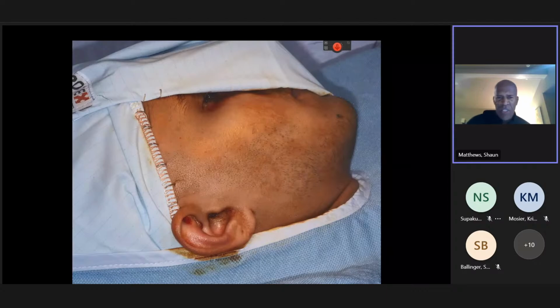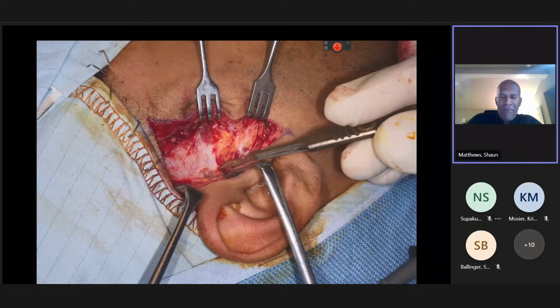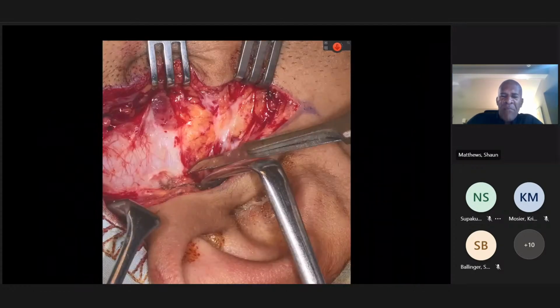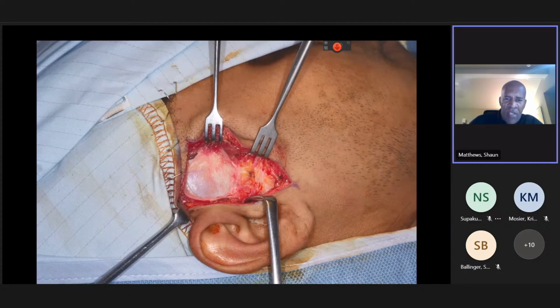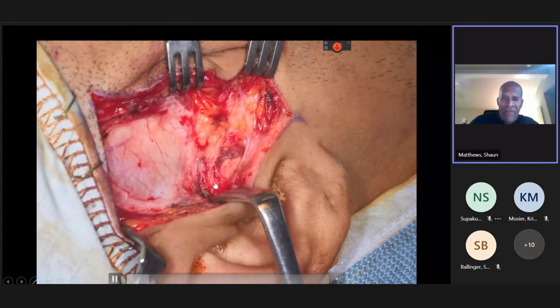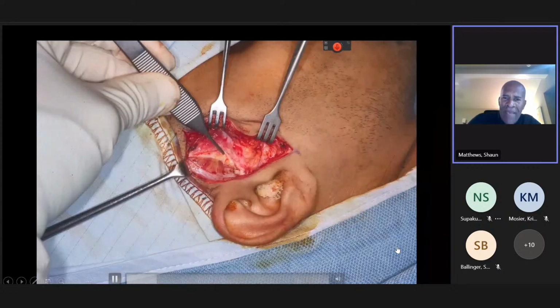Very quickly, this is a surgical approach that I use when I am doing an eminectomy procedure for a patient with recurrent TMJ dislocation. We have the pre-auricular approach shown previously. We are dissecting down into the jaw joint. My first anatomical landmark is shown here. This is the temporalis fascia, this white gleaming layer of fascia. And then once we have incised through the fascia, I'm looking for these tiny globules of fat shown here that will get me into the superficial temporal fat pad.